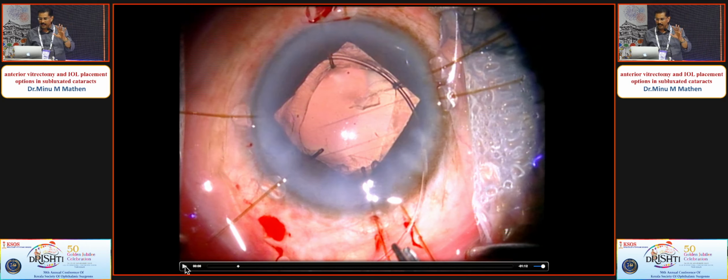After this we need to know, as we are seeing nowadays, that 15 years after pseudo exfoliation phacos, many of them come with a decentered IOL. Almost every week I see one with a decentered IOL bag complex. They mostly decenter after surgery. Without surgery, the lens remains there. It dangles, but it remains there. But after surgery, the Rexis contracts and the peripheral zonules are weak, and zonules keep giving way, and the phimosis and the contracture of the bag will accelerate this process.